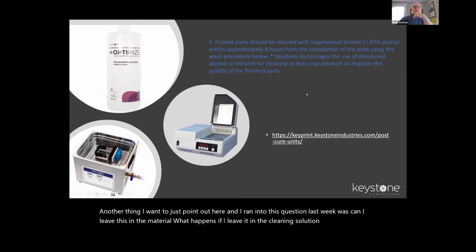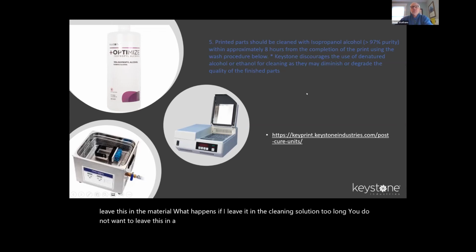You do not want to leave this in a cleaning solution, or any of our printed material in it, for more than a couple of hours at tops. You want to make sure that you're taking it out and drying it off when you're done with the post-curing and or washing, because if you leave it in there, it will cause problems with the material. So please don't leave it overnight in a washing station.